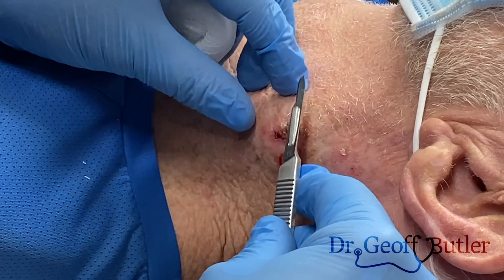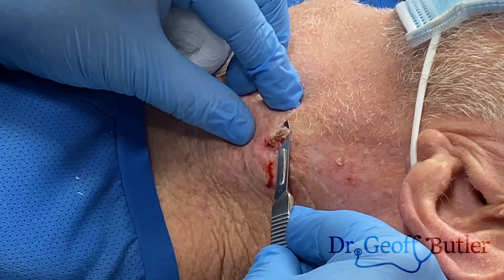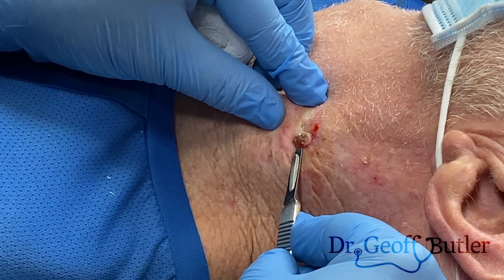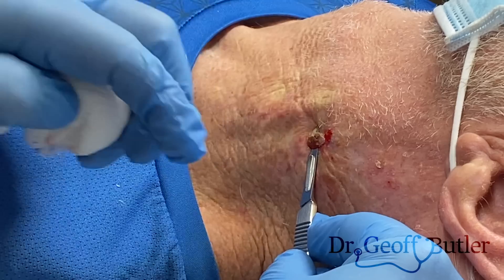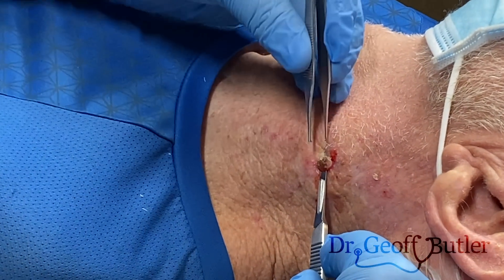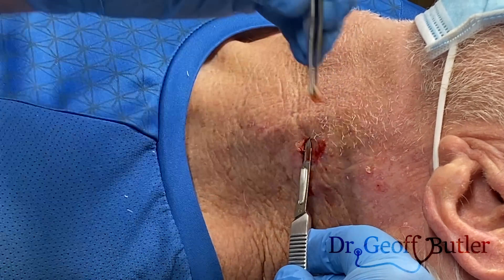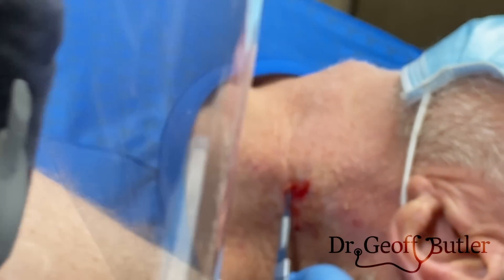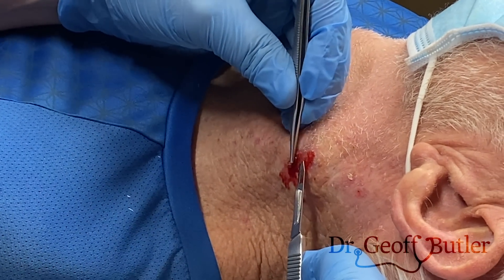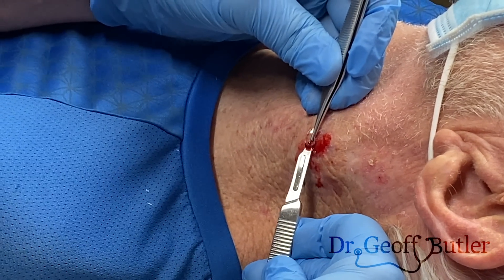So again, this is a number 15 blade. Essentially I just want to do a very superficial shave, just like this.